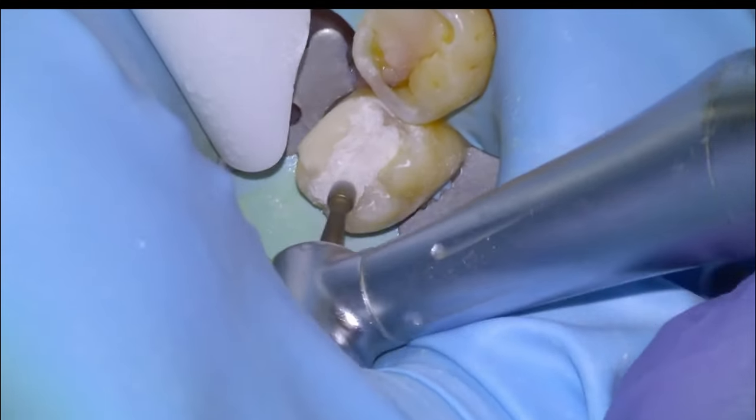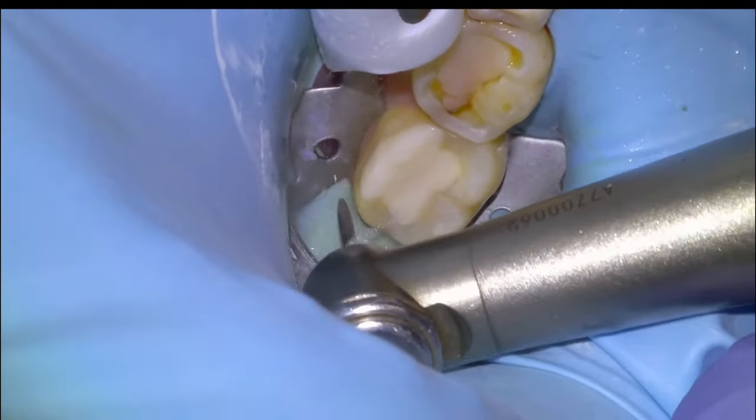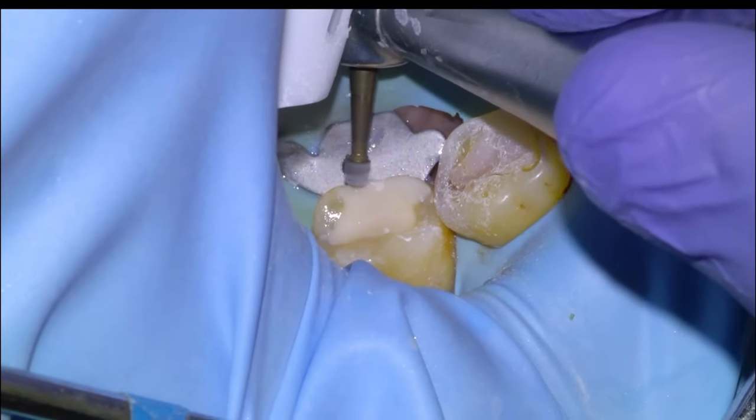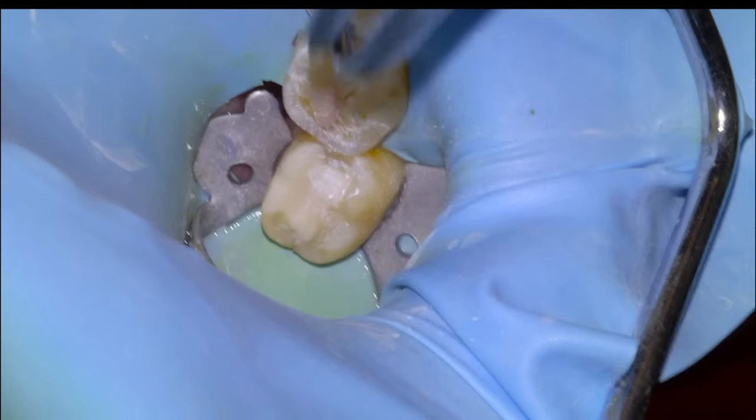So we'll just remove the bulk excess with a large round diamond and then do the fine finishing with a flame bur on a slow speed. I like the slow speed — you can really see the margins when the material dries out.